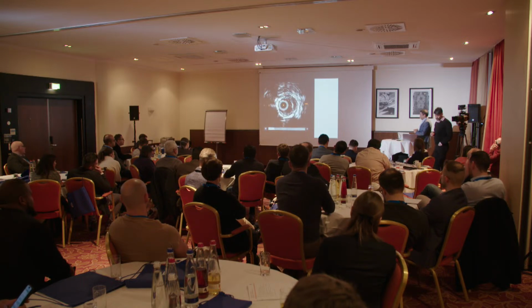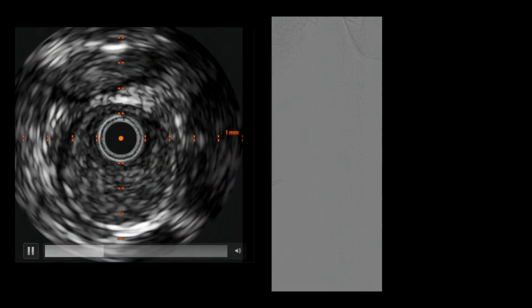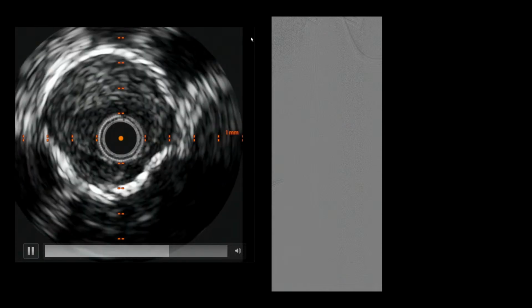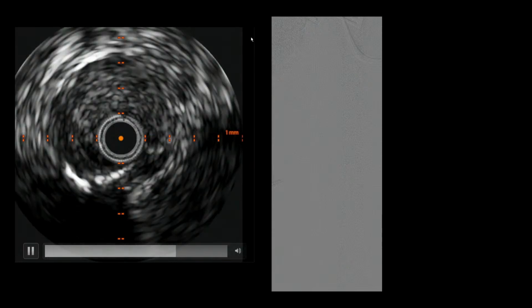Okay, so if you have a look at the difference here, what's going on in the vessel? All I've done so far is vessel prep this with IVL. What's going on inside the lumen now? This is that mid SFA that I treated. Originally I was in the lumen, and you saw the black center. I've not done much here. The ACT is normal. Does anyone have any thoughts on what that might be? Black in the lumen is blood flow. So what's this speckly stuff?